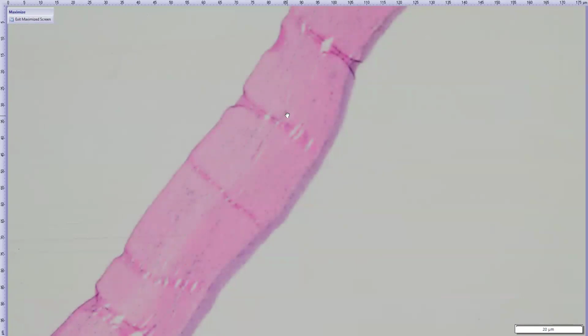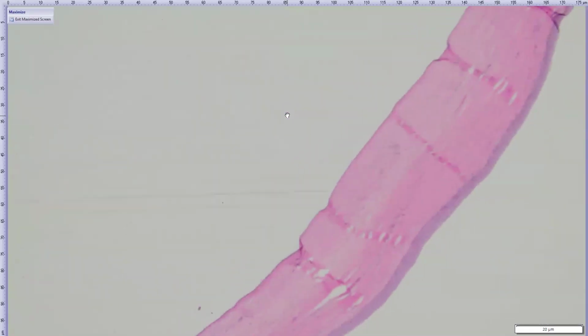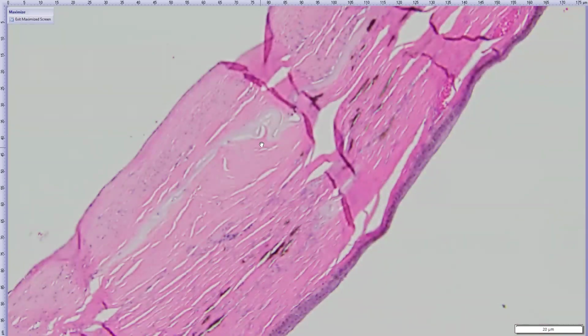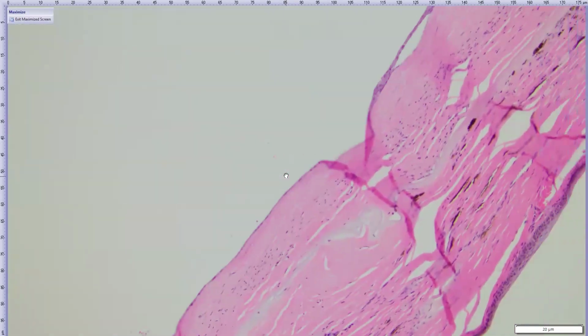The other thing we can notice is that deep in the corneal stroma, we do not have any Descemet's membrane, aside from a couple little curled up fragments here that were left behind from the surgery. And what's covering the inner surface here of the cornea, and goes circumferentially around the scleral shell, is this dense collagenous tissue.